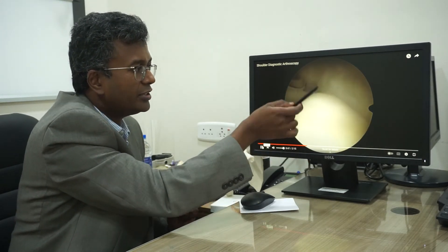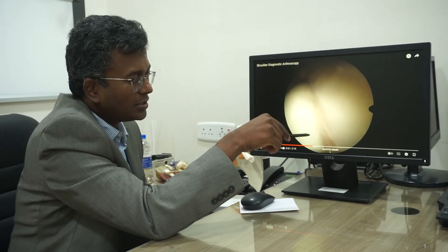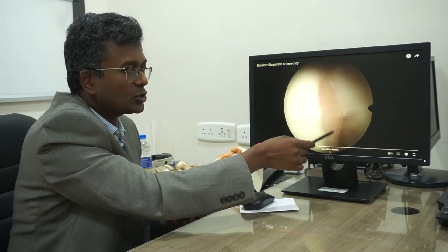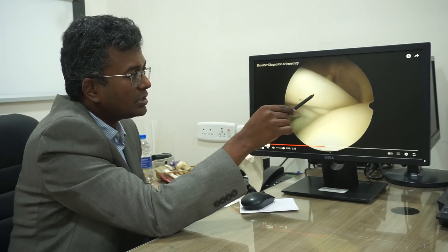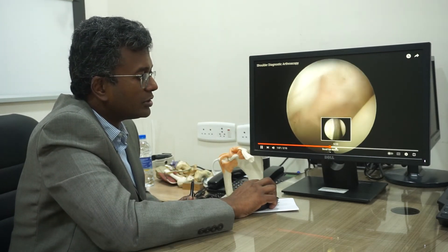Coming to the back side of the shoulder, we see the bare area, which is a normal finding — not a Hill-Sachs lesion. Coming back to view the biceps and cuff muscles again from another angle, we can see the inferior recess and the labrum.